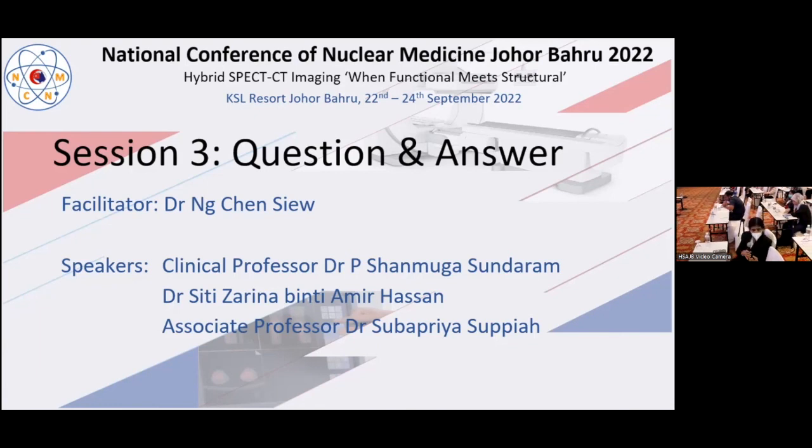So as the doctor said, we always do imaging at 7 minutes and at 2 hours. But if you already have a previous scan where the parathyroid is negative and PTH is still high, we have the entity of rapid washout, then do a 1-hour imaging. Depending on that, do a SPECT-CT. And for those patients with high serum creatinine values, try to delay the image instead of taking 2 hours as recommended, take 3 or 4 hours so that we can have diagnostic accuracy.